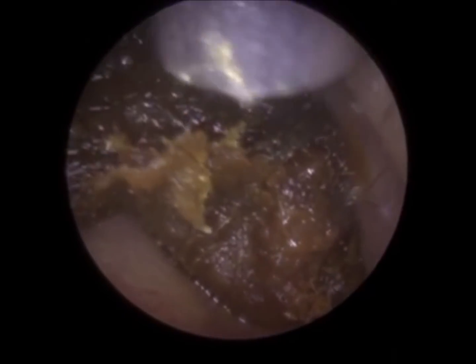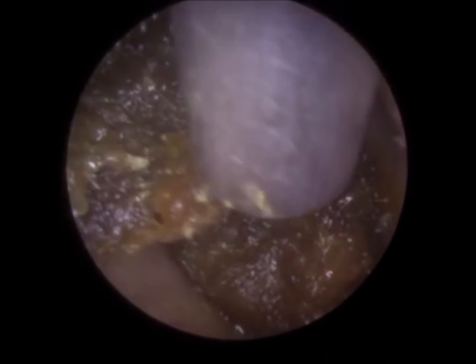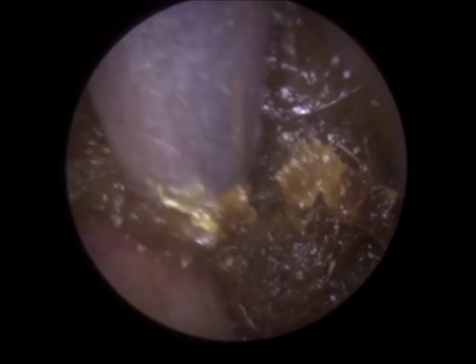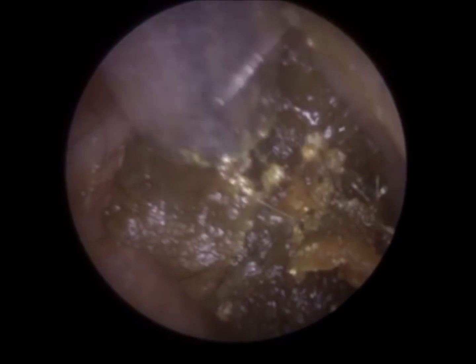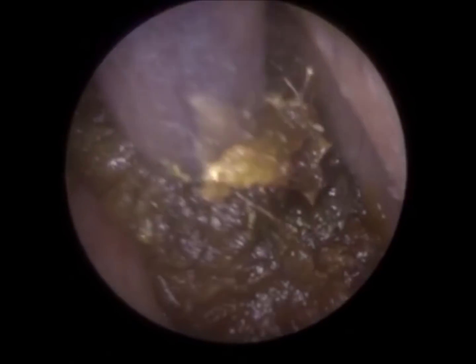This client actually attended today. Upon attending, the wax is quite glutinous, quite sticky. You can see there, I'm just trying to loosen it off the canal wall. So just posterior canal wall. So posterior means the back part of the ear canal. I'm now going to the roof of the ear canal. You can see where it attaches to the ear canal. There's a few skin adhesions.